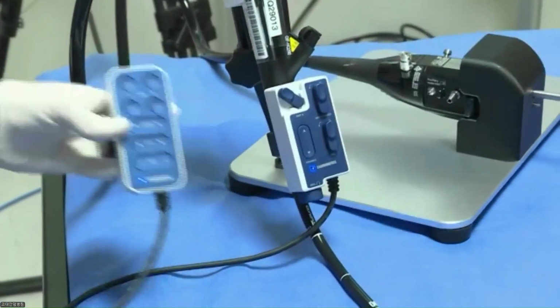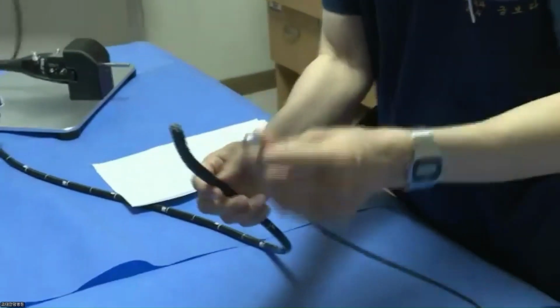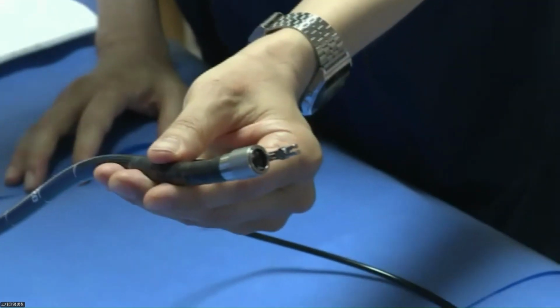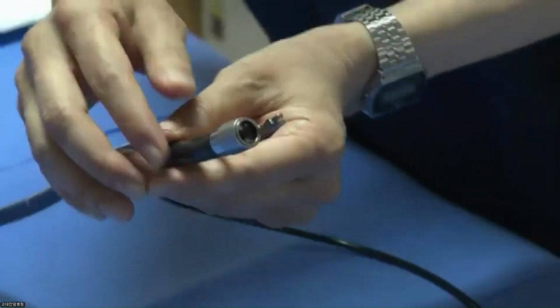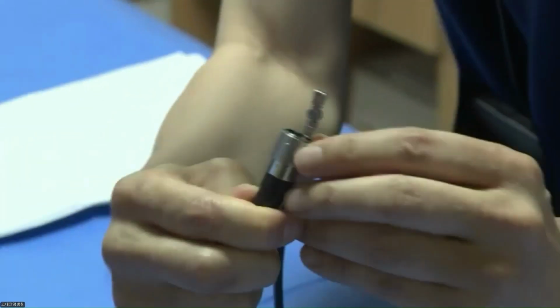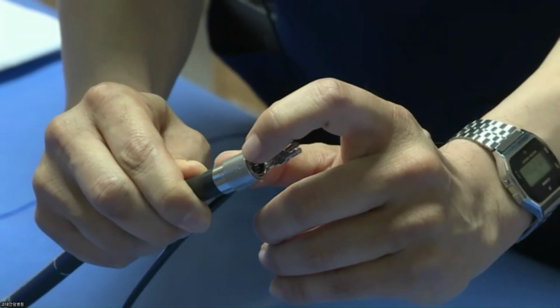This is the Olympus endoscope, and you can just fit it in at the end of the endoscope. It's not that difficult. You can just fit it in at the head of the device, at the tip of the endoscope. Can you see this marker? Here is the arrow marker.